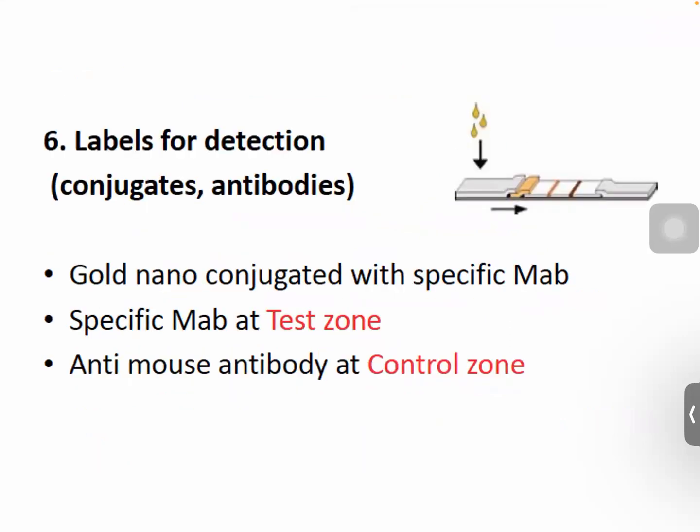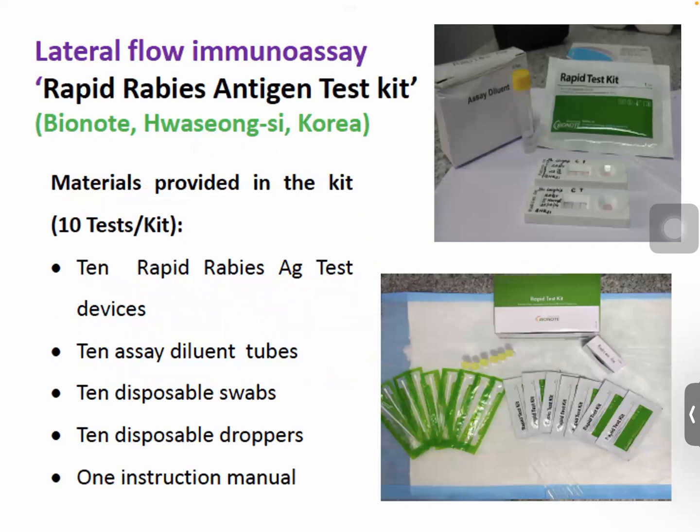Okay, right. This is the process of labeling, as I mentioned just now. I think we are going to discuss this in the second part of the lecture. So make sure that you have identified the correct biomolecules that you wish to detect, the suitable bioreceptors, and this has to be done before the process of fabrication of lateral flow started. So basically, what should be in the test kit using lateral flow.